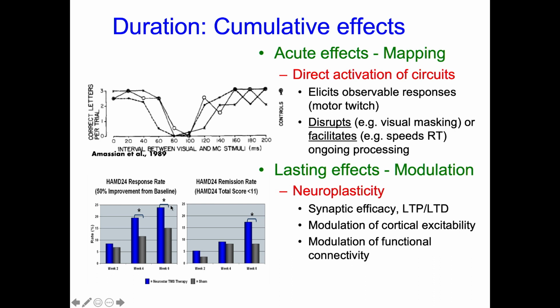And that's what we saw right in the beginning, where this is weeks of stimulation, stimulating every single day for 37 minutes. And you did that after 2 weeks, after 4 weeks, after 6 weeks, and you can see the effect growing and growing. And those effects can last months to years. What you're doing there is creating epigenetic changes in the brain. You're creating, in the synapses rather, changes that last much, much longer because you're programming them in through the DNA in a way that lasts even years, but basically at least months.